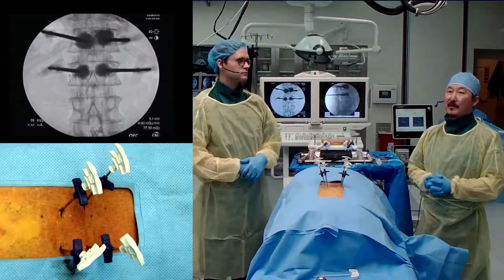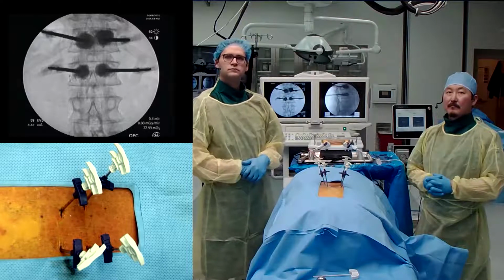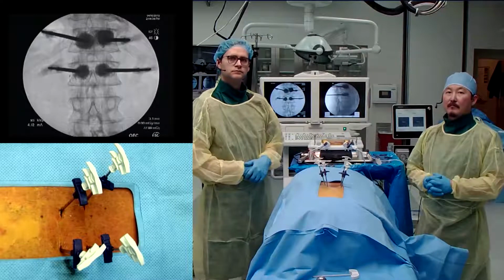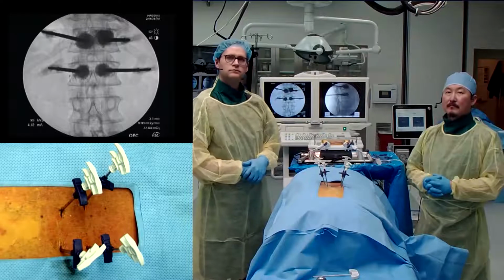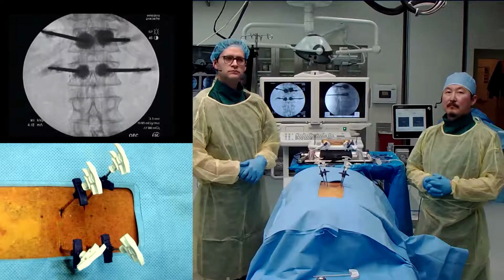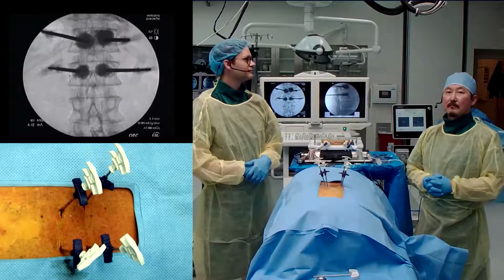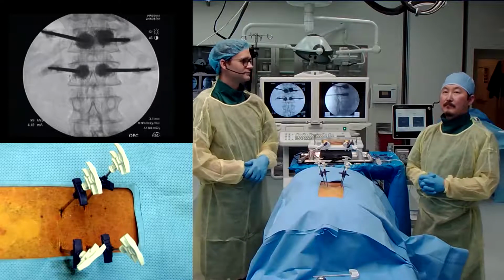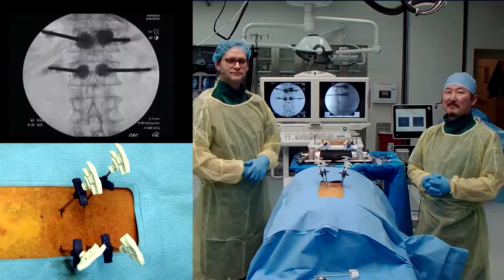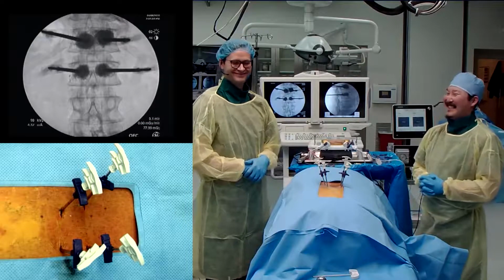That's an excellent point. That is really the critical part. I think the critical part is really placing the needle. That is the difficult part. The cement and everything else, you get used to it. But don't advance the needle further than the medial wall unless you are already in the vertebral body. Jeff, you're a master. I can never get my kyphoplasty and vertebroplasty to look like the x-rays you just showed. Thank you. I have really good help here to keep me in check.